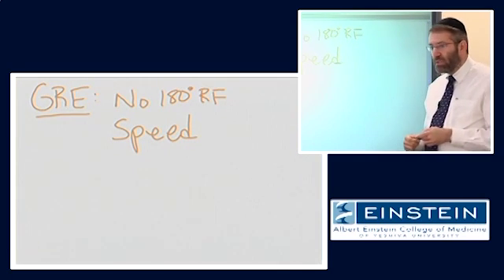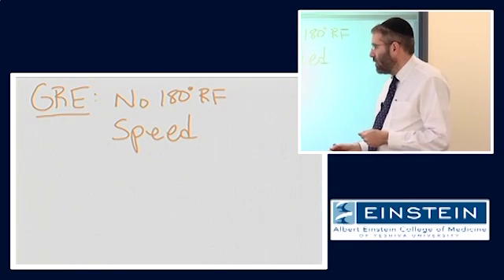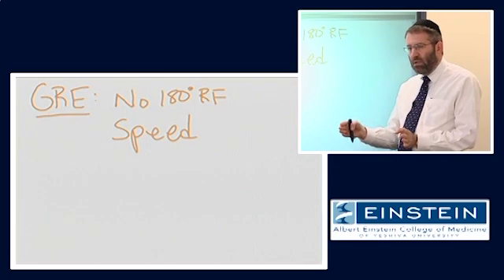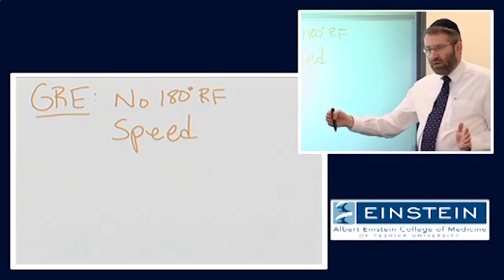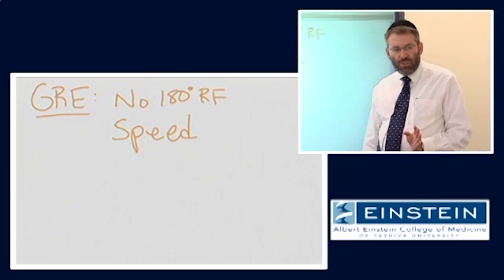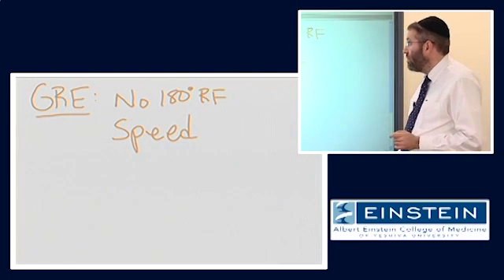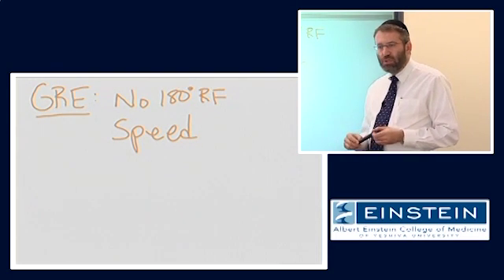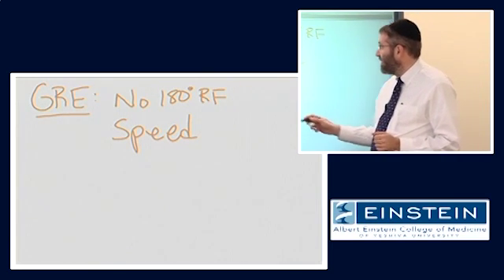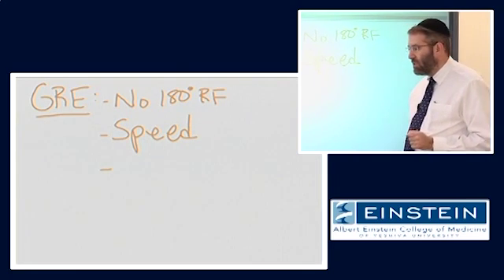Right? As a result, with gradient echo pulse sequences, we are ready to repeat things very quickly, which means that within a given TR, you could potentially excite many more slices. Or, as we'll talk about in just a minute, we might actually be able to image with a much shorter TR overall.